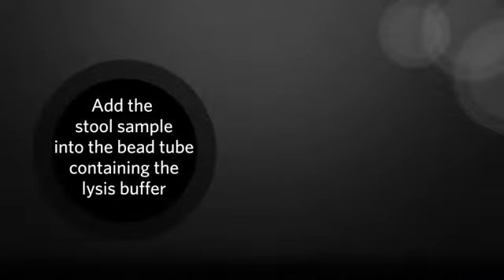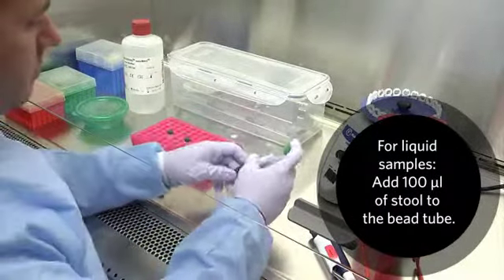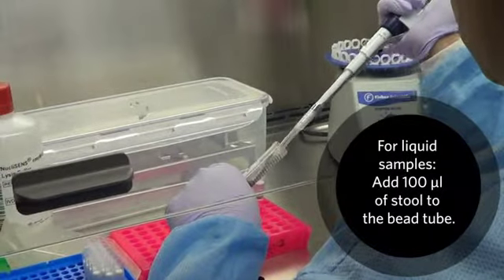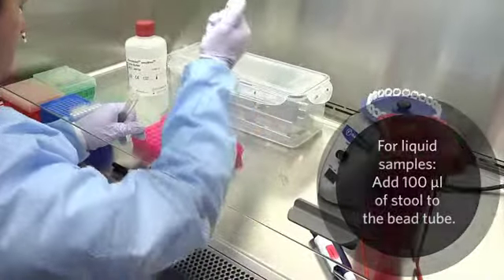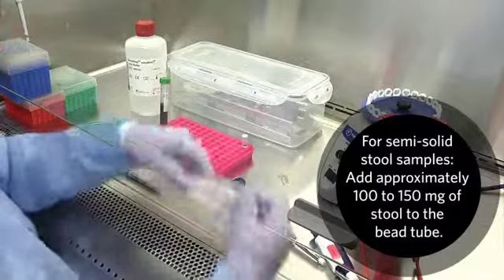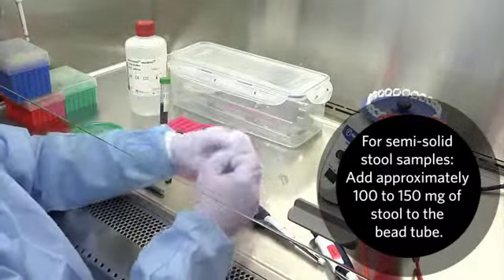Next, add the stool sample into the bead tube containing the lysis buffer. When pretreating a liquid stool sample, add 100 microliters of stool to the bead tube. For semi-solid stool samples, add approximately 100 to 150 milligrams of stool to the bead tube.